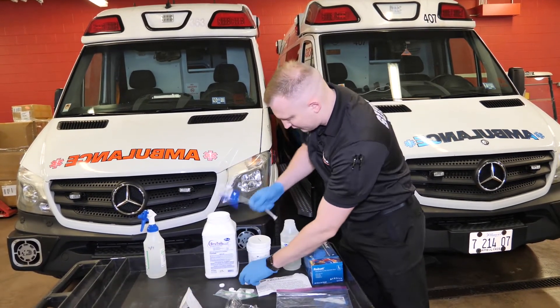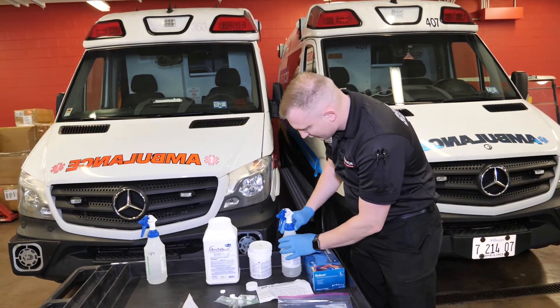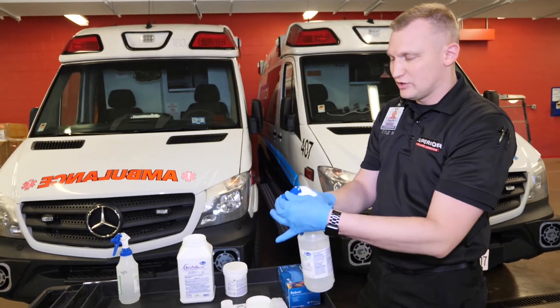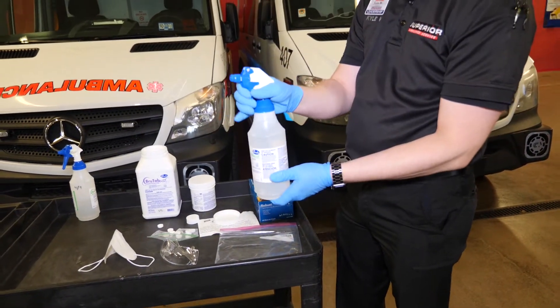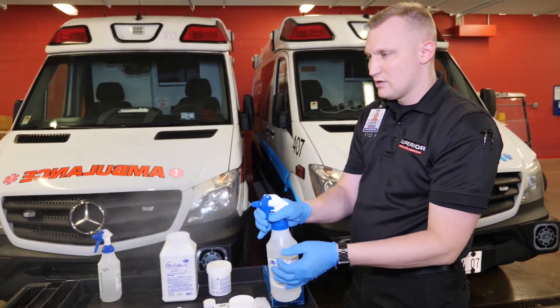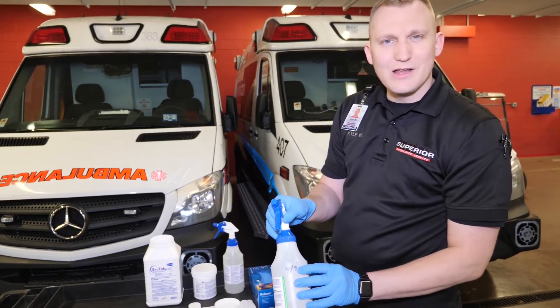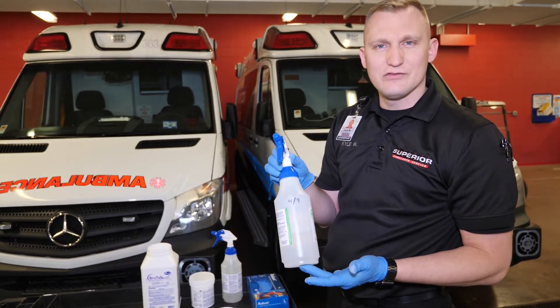Once that dissolves, you're going to put your spray bottle mister onto the top. They typically come in the locked position, so you're going to want to adjust it until you get a nice misting solution. On the bottle, we want to take a piece of tape and write the date of when we use this product, as the product is good for five days.